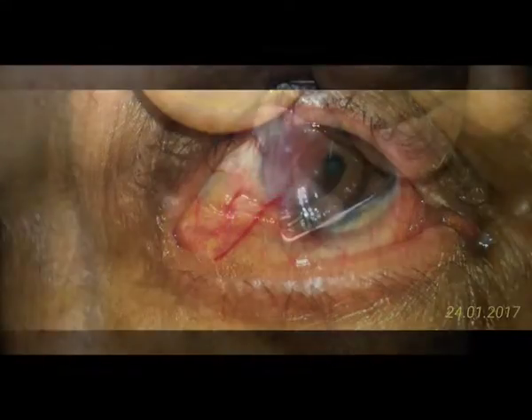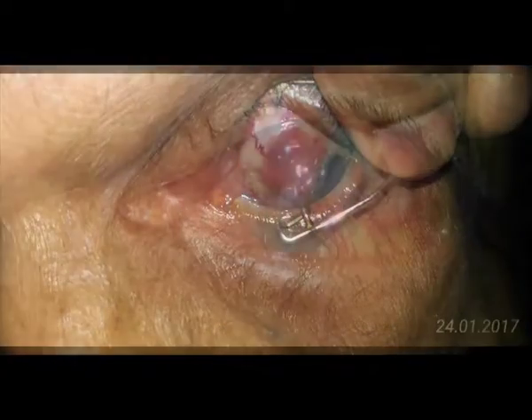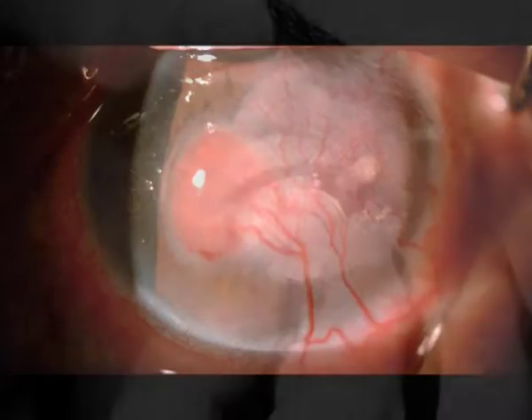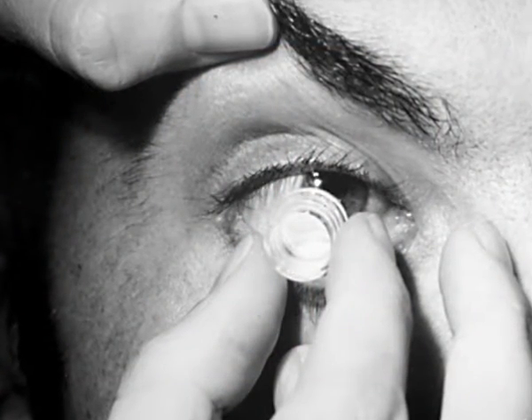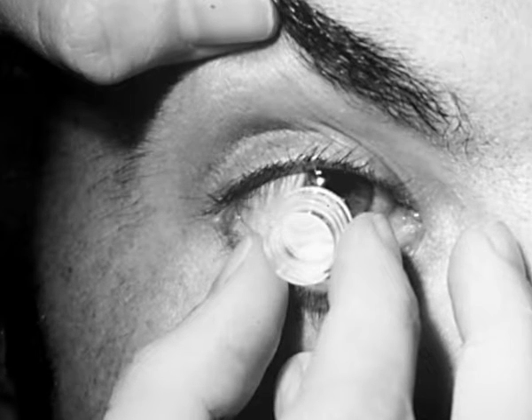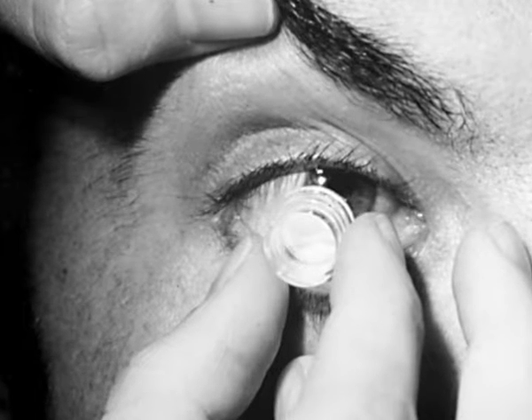The main investigative tool in our study was a new technique of impression cytology. Impression cytology with biopore membrane can miss about 20% of cases, as there is loss and distortion of cells in the pores of the membrane.